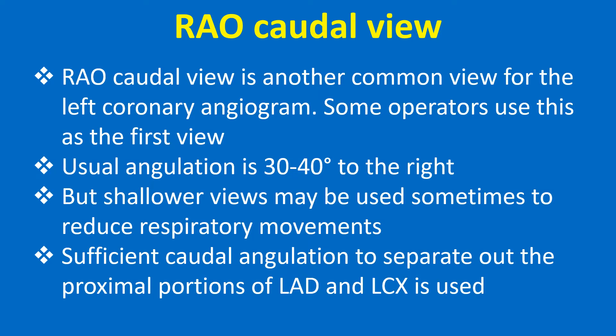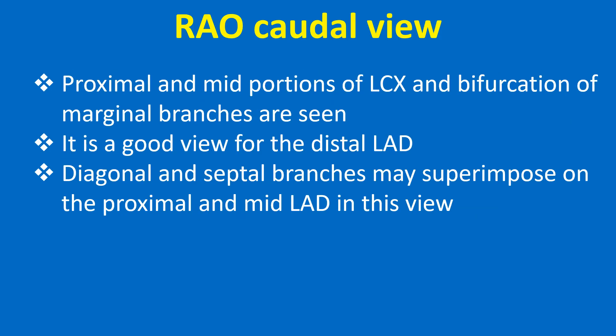RAO caudal view is another common view for the left coronary angiogram, and some operators use this as the first view. Usual angulation is 30 to 40 degrees to the right, though shallower views may be used to reduce respiratory movement. Sufficient caudal angulation is used to separate out the proximal portions of the LAD and LCX. Proximal and mid portions of LCX and bifurcation of marginal branches are seen, and it is a good view for the distal LAD.